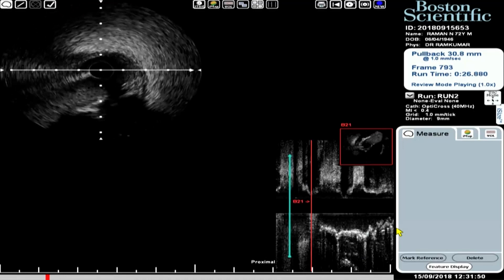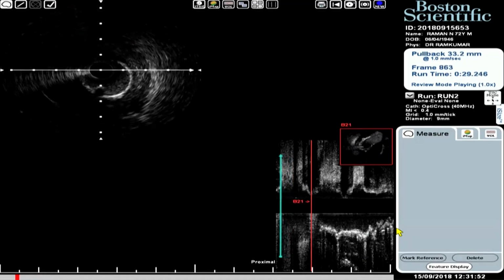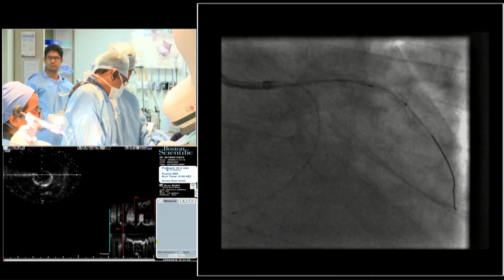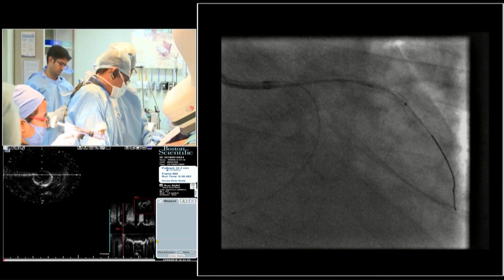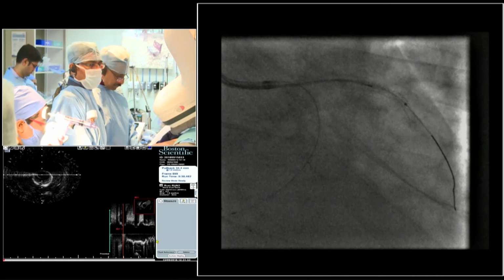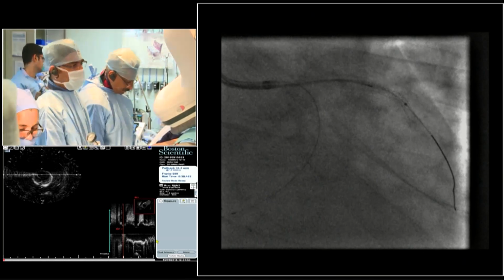If at all, a cutting balloon might cut at some more places. It may not. Alan, we used an AngioSculpt 2.5, but not a 3. And initially an OPN balloon 2.5 and an NC balloon 3. And hopefully we get reasonable areas. With an area around 5 millimeter square, I'm happy here. Okay, so let's now get this through. And it was expanding a bit eccentrically, so we don't want a rupture at the ostial LAD part also.